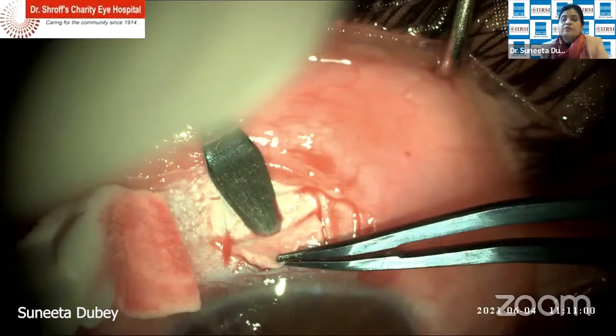I use crescent because I dissect into the clear cornea and leave a millimeter of sclera undissected on the sides. That's, I think, the key. What Sunita mentioned: we don't want the scleral flap to go up to the cornea on the periphery. In the center it goes up to the cornea. On the periphery, you just leave it.